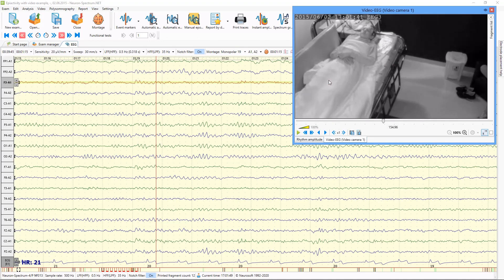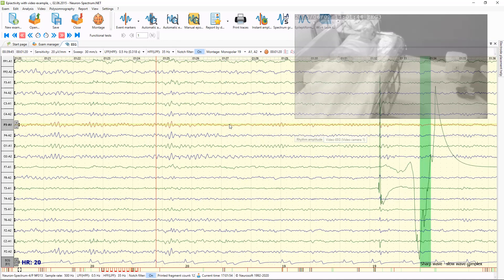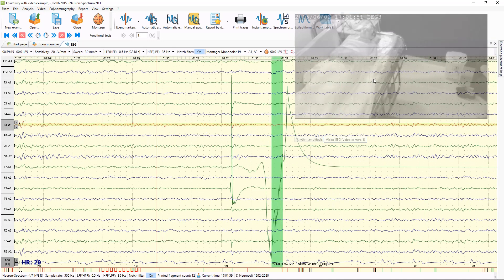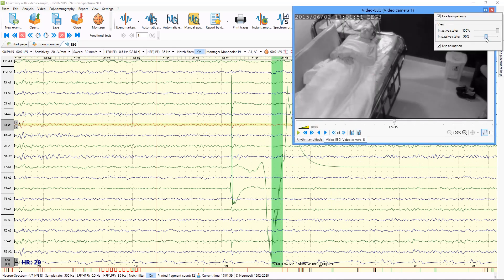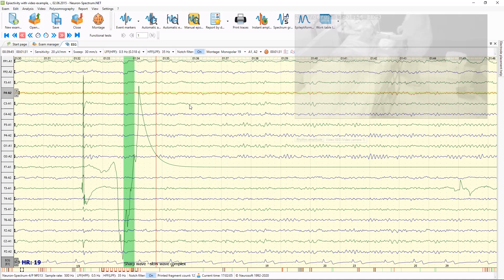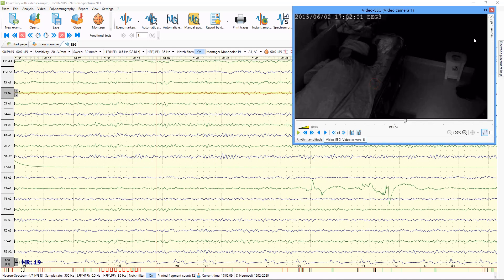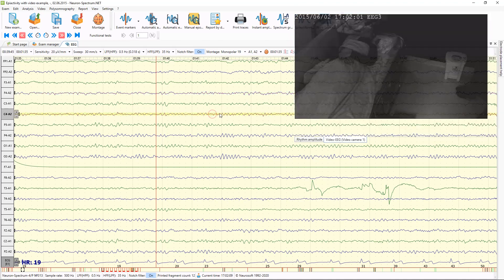If you press the button, the video becomes semi-transparent. You can also manage the transparency level — making it more transparent or less transparent.